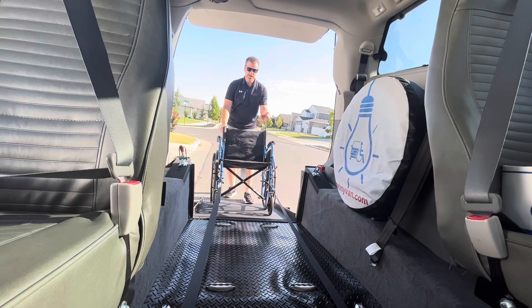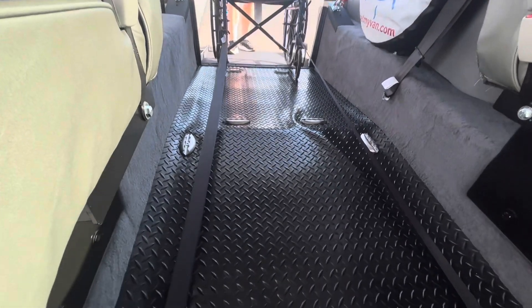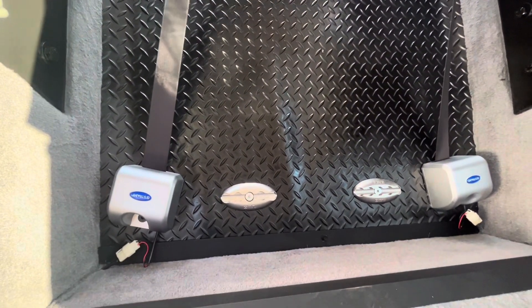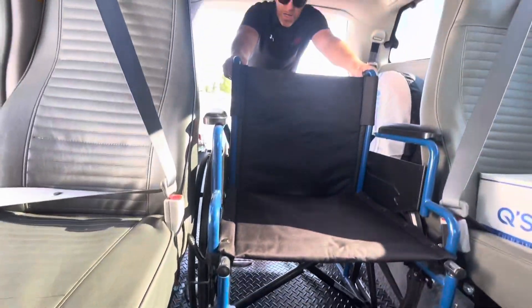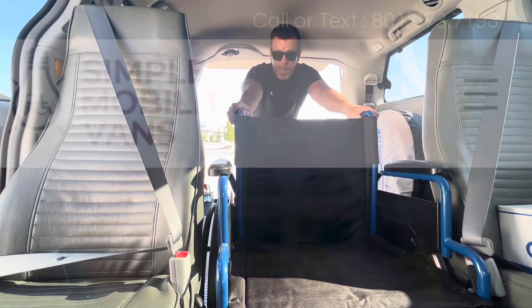We start to push this chair up the ramp, and now you can look at those Q-Straints in the floor — you can hear them auto-retracting the closer we get to them. Until you put the patient in the position you prefer, you lock them down, and then you only need to install the rear Q-Straints and lock those down.